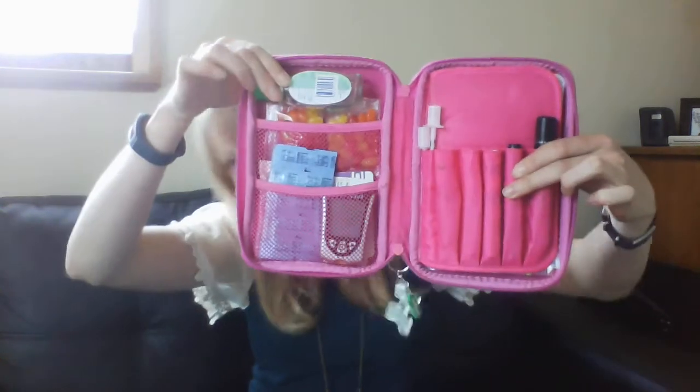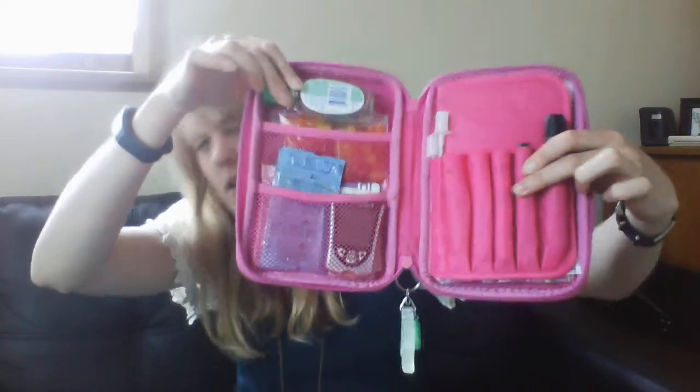I'll just give you a quick look at what is in here. That's my diabetes bag. In the first bit, I have Dettol hand sanitizer. I just keep that with me all the time in case I'm out somewhere or I'm hiking or something. I've eaten something quite sweet or some fruit and got it all over my hands, and there's nowhere to wash my hands, so I find that this is quite helpful for that. Also, if I'm doing a site change somewhere where I can't wash my hands, or if I have washed my hands but then I've gone and scratched my head or something like that, I just keep that on standby.